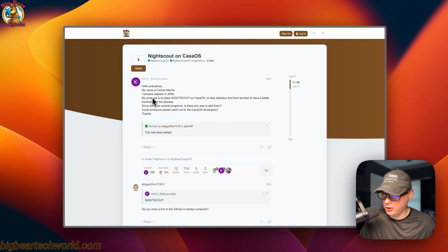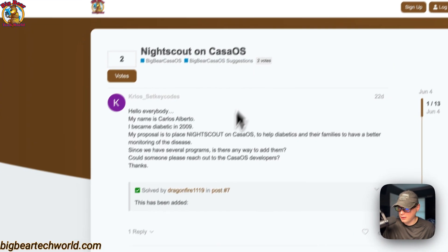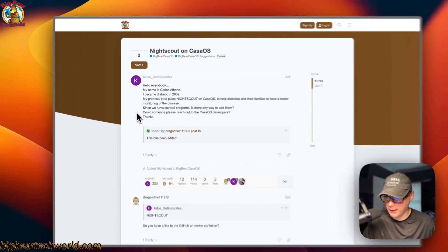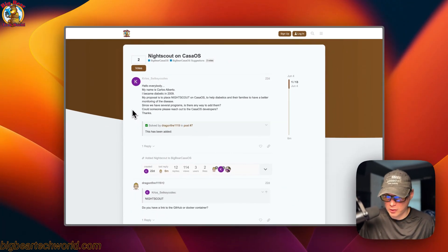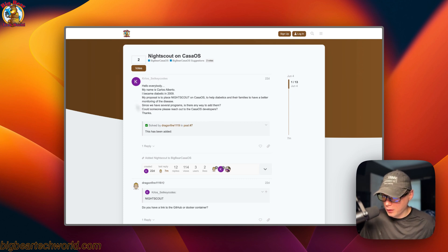I got a request to add Nightscout on CasaOS from a person named Carlos Alberto. He's been a diabetic since 2009 and wanted this added, so I tried to get it done as soon as possible. I did it for CasaOS first, but I wanted to bring it to more and more platforms to help more people.